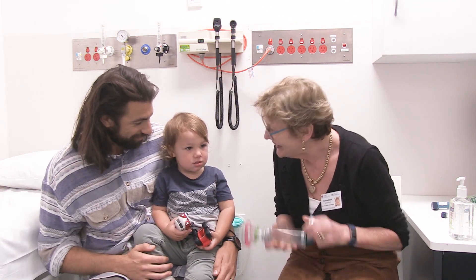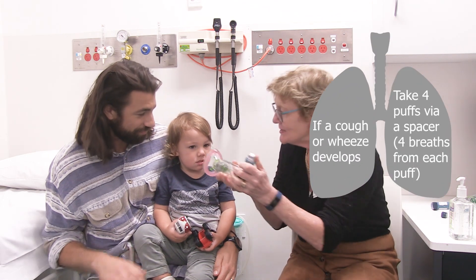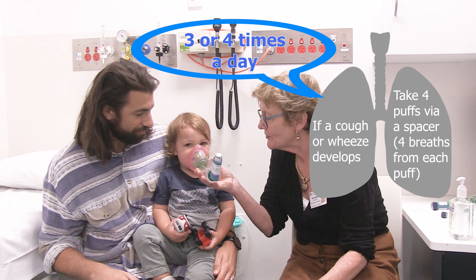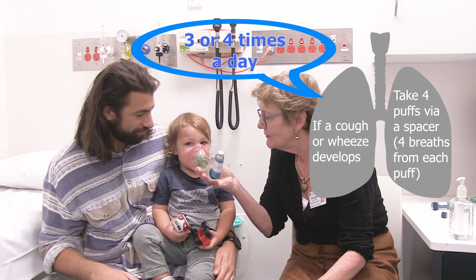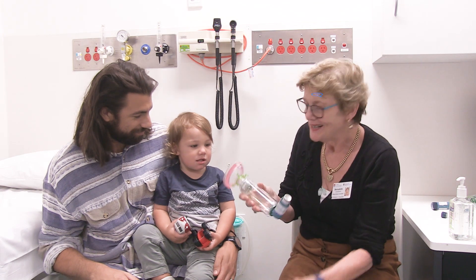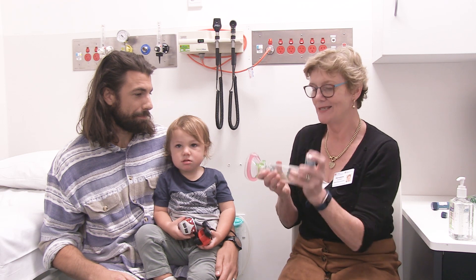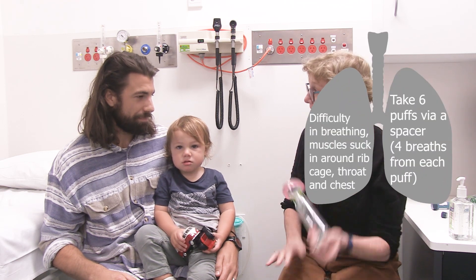We do one more — we have to give it a shake and we do one puff, four breaths: one, two, three, four. That's so good! So what we have to do is make sure it's got a nice seal around his face, and we shake it every time and he has one puff, four breaths and that's it.